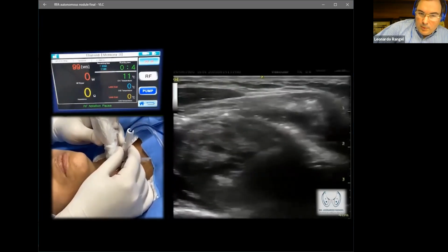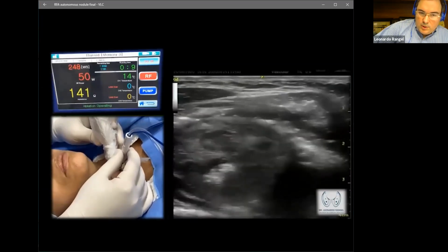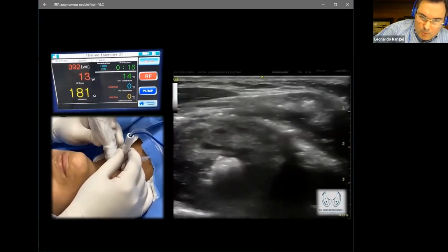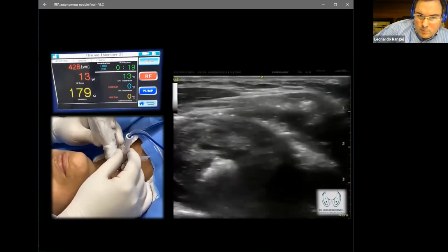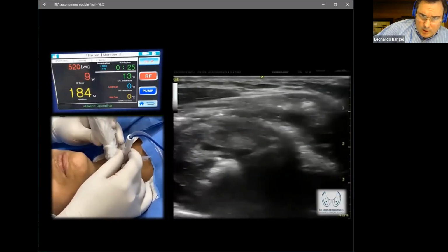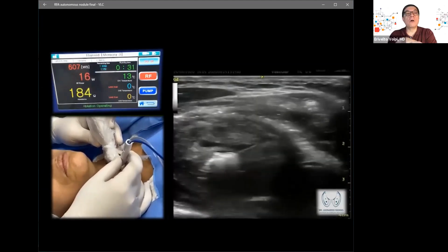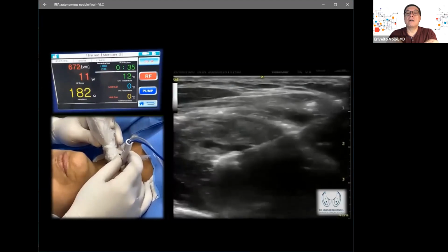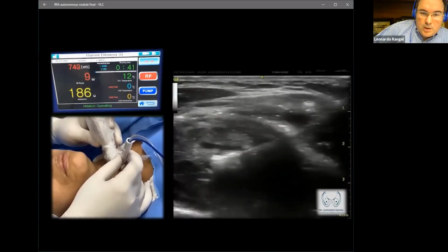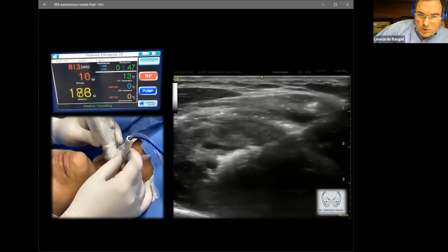So that's why we really start with lower power. And if the energy needs to be increased, we increase it in a stepwise approach, with some 5-watt increase each time. So when we start the ablation, it's very interesting to note how comfortable the patients are. It's important that we speak with the patient at all times. So we check the voice and how comfortable the patient is.